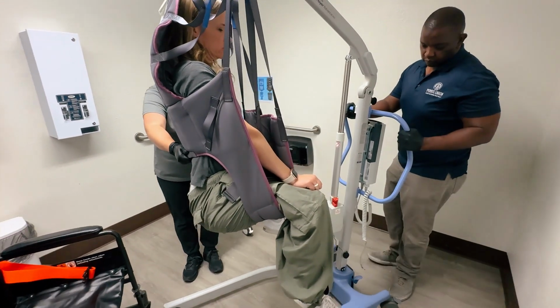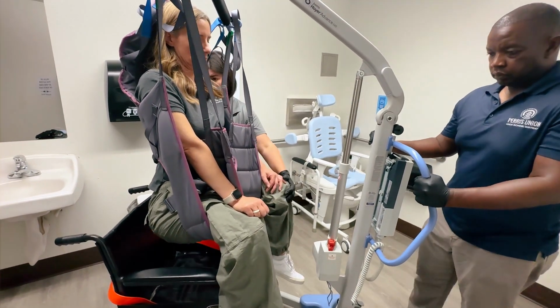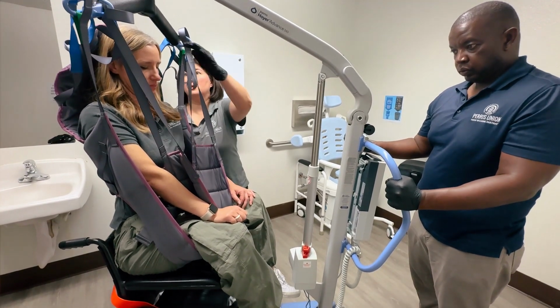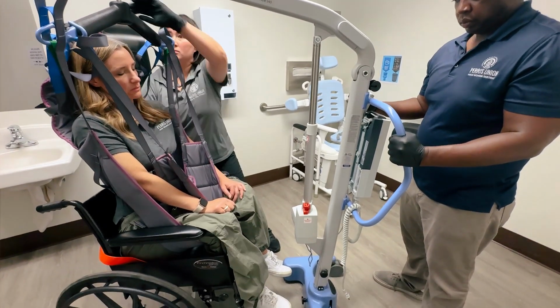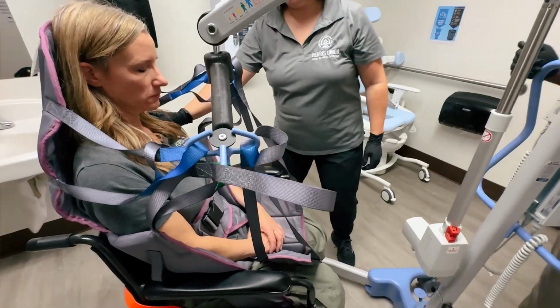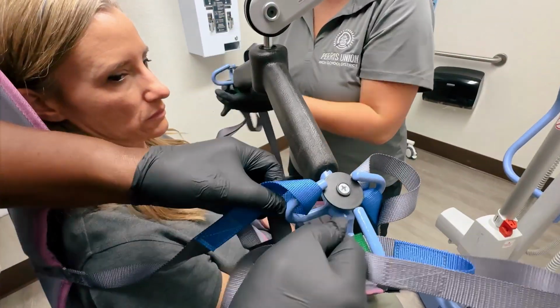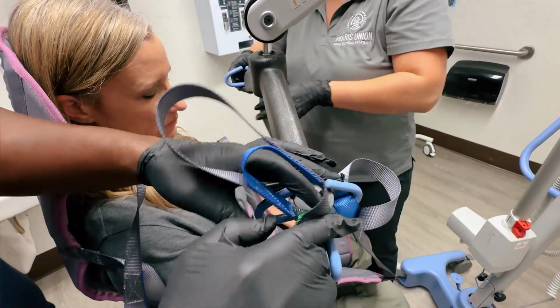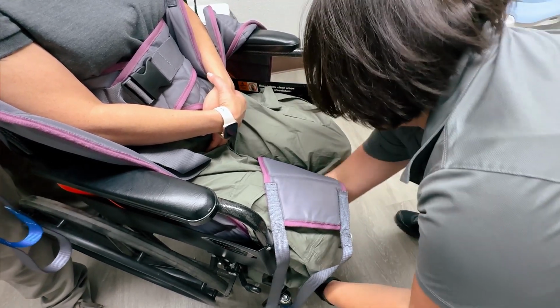Transfer the student back to their wheelchair with one assistant guiding the sling and one assistant navigating the Hoyer. Lower the student into their wheelchair and position them in the center of the wheelchair. With one assistant in front of the student and the other assistant behind the student for support, remove sling loops from the Hoyer lift. Remove the sling leg straps and unbuckle the waist strap.